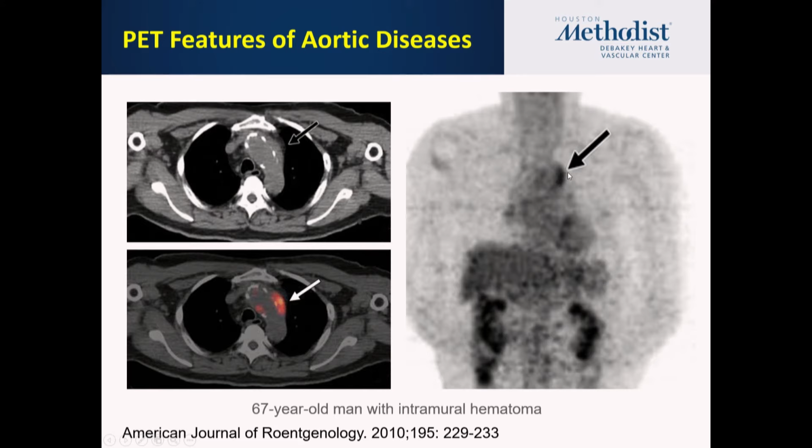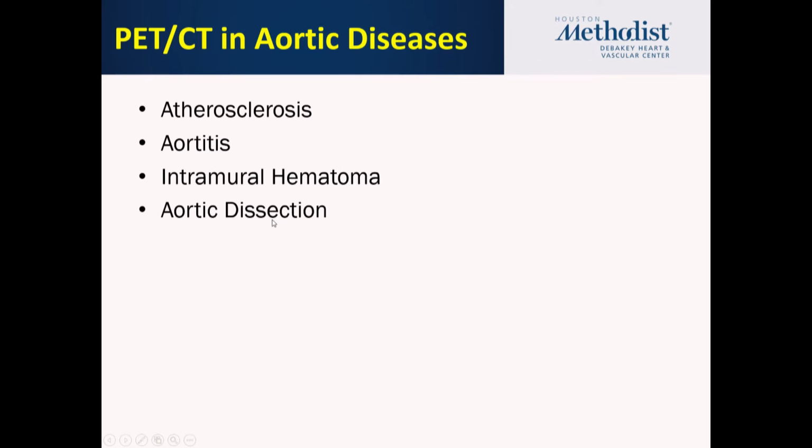Whether this was going to expand and will have long-term sequelae still has to be determined. What's the added value of PET in these specific areas? Another area is aortic dissection, and sometimes, as you know, we struggle to know whether this is acute.